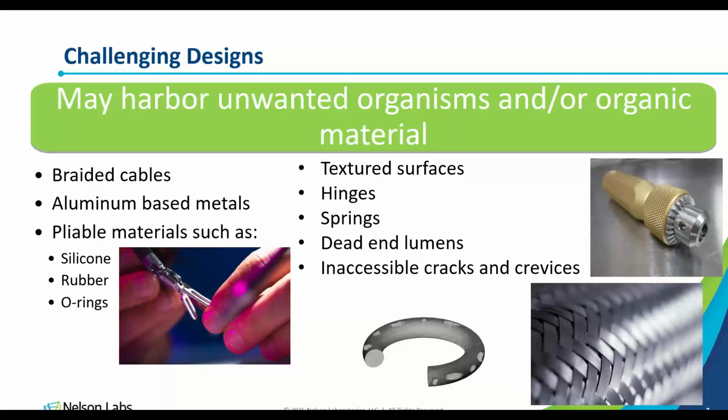Then you have to go back and redesign it to make it cleanable, and maybe redo some of those other tests along the way as well. So if you keep reprocessing in mind at the beginning, during design development, it will save you a lot of time and money and really headache at the end.